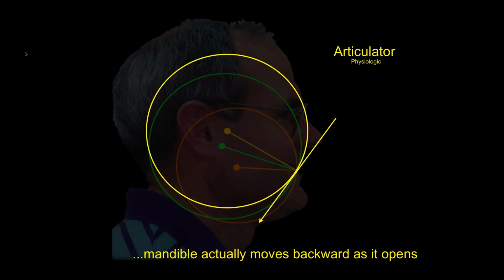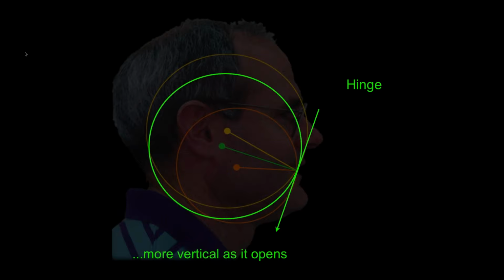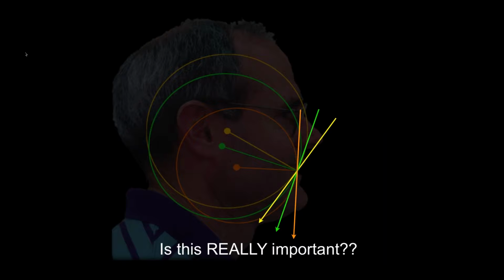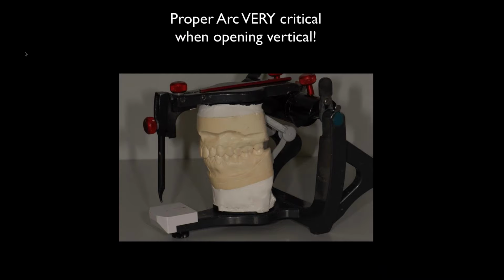And if we dig into this just a little bit, look at this. That's physiologic. That's articulator. The mandible actually swings backwards slightly as it moves down. Okay, if you look at a hinge, which is the next best thing, I guess, the mandible moves a little bit more vertically. And on a plastic articulator, it moves almost straight vertical. And this is a huge problem, particularly if you're opening vertical. Okay, if you're just doing a single crown and running around, it's not that big a deal. But if you're opening vertical or mud open vertical, this becomes extremely critical.